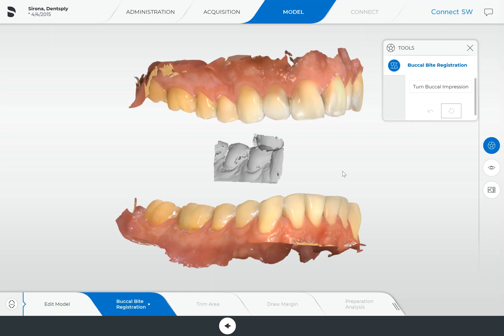Thanks for joining us today at CAD CAM Hacks. We received a question recently in regard to the manual buccal bite registration in the Connect software. This one is specifically with a PrimeScan, and I wanted to review just why you're being asked to do a buccal bite registration, some things you might want to consider doing differently, and then how to actually do the manual registration.